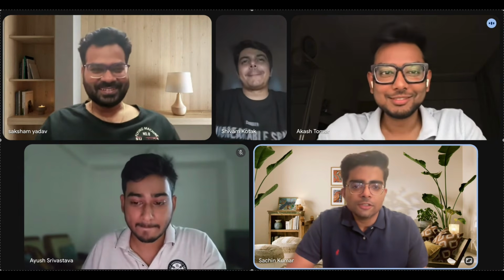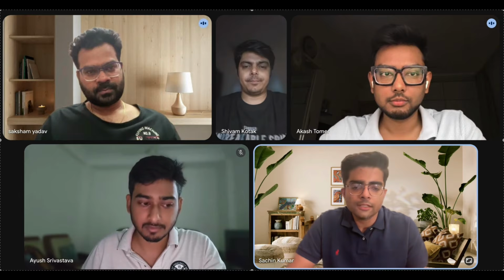Okay. So, Dr. Shivam, you are an assistant professor in the radiology department of a medical college, and you've been using Quillr, I think, for the past 1 month. As an assistant professor who teaches residents, how has the experience with Quillr been? So I feel it is quite a time saver. I started using it as an intelligent transcriptionist. I just dictate my positive findings and it formulates them into a very comprehensive and articulate report.